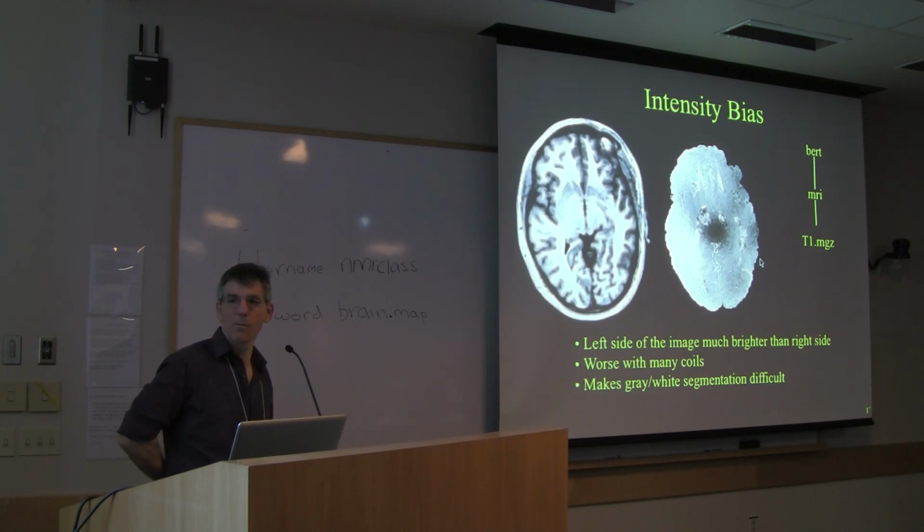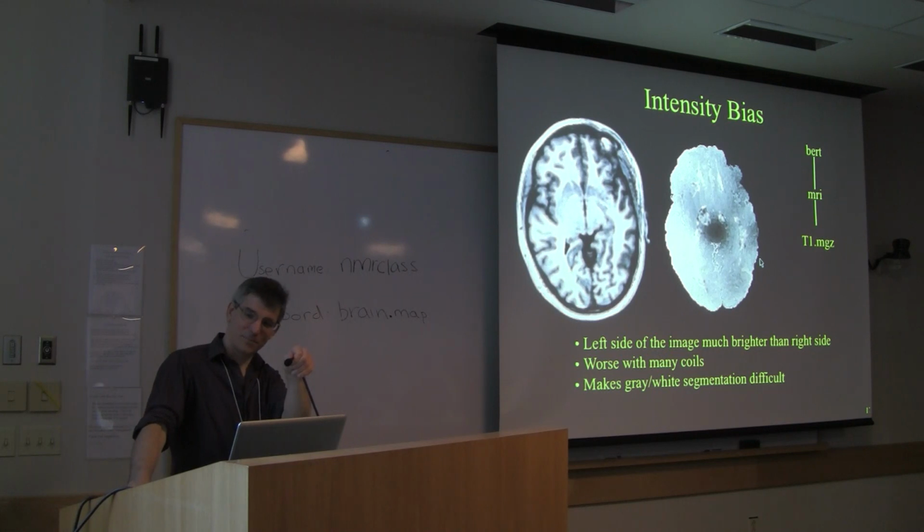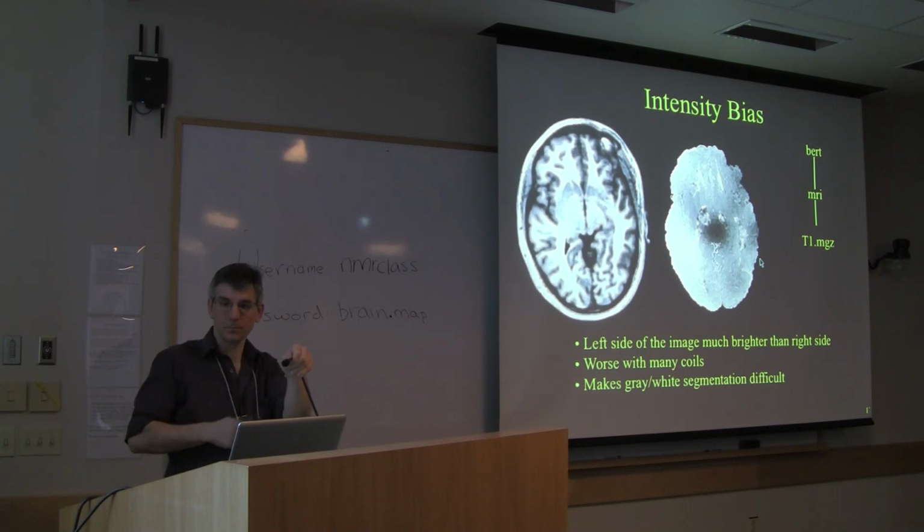It's a bigger deal at 7T where you have dielectric effects, but it's hard because dielectric effects are so bad that you get pile up. So the other problem is that for the B1, there's no closed form solution for what an MPRAGE looks like. It's not a steady state sequence. So for an SPGR, you have a steady state sequence, and it's easy to kind of stick a B1 map into it and correct for things. But for an MPRAGE, it's hard because the MPRAGE depends on the anatomy because it has this kind of strange frequency filter in it. So yes, we have some tools for incorporating B1 maps that have made things somewhat better at 7T if you're doing Flash or SPGR, but not really for MPRAGE.